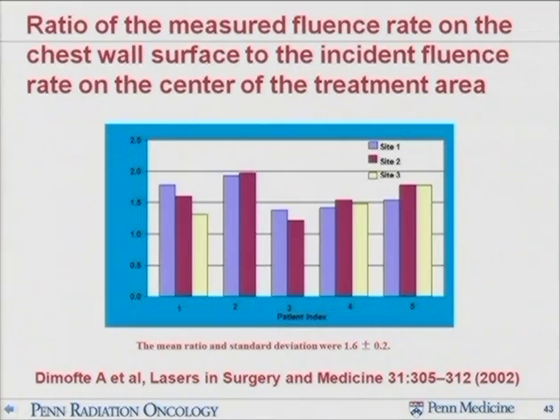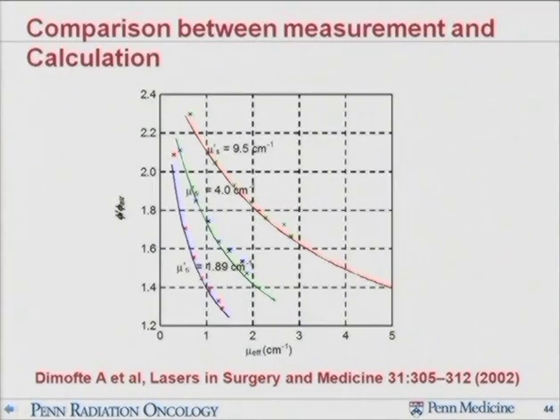The reason for that is the optic property for the patient is different. One can develop a theory which is basically using the scattering coefficient mu s prime and the effective mu effective. So these two quantities, the pair of mu effective and mu s prime, is giving you the entire mu a, mu s prime of the optic property. You can find that they can nicely be modeled using diffusion model, the curve of what this ratio should be.